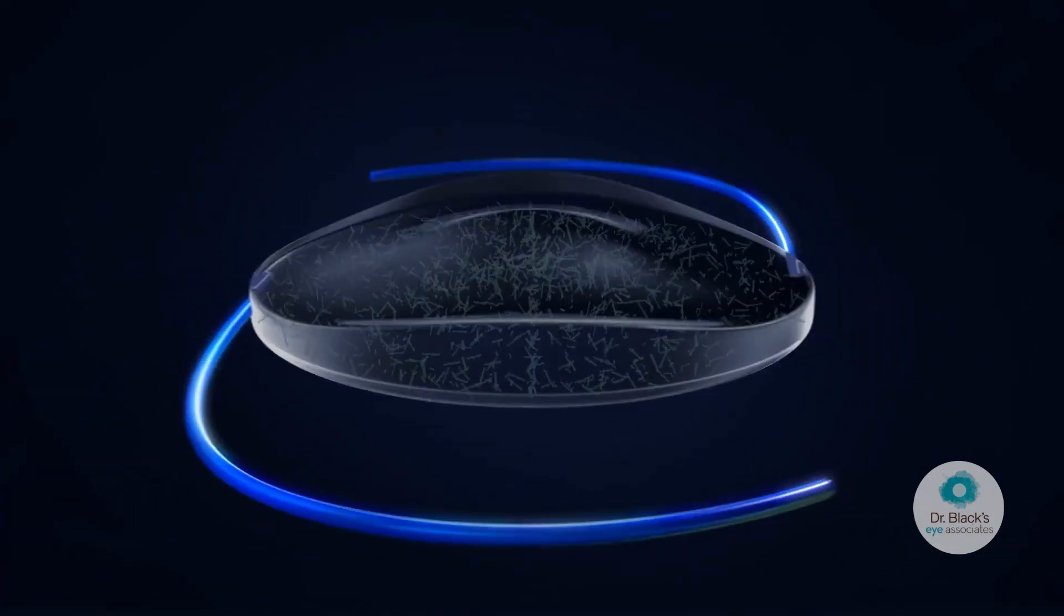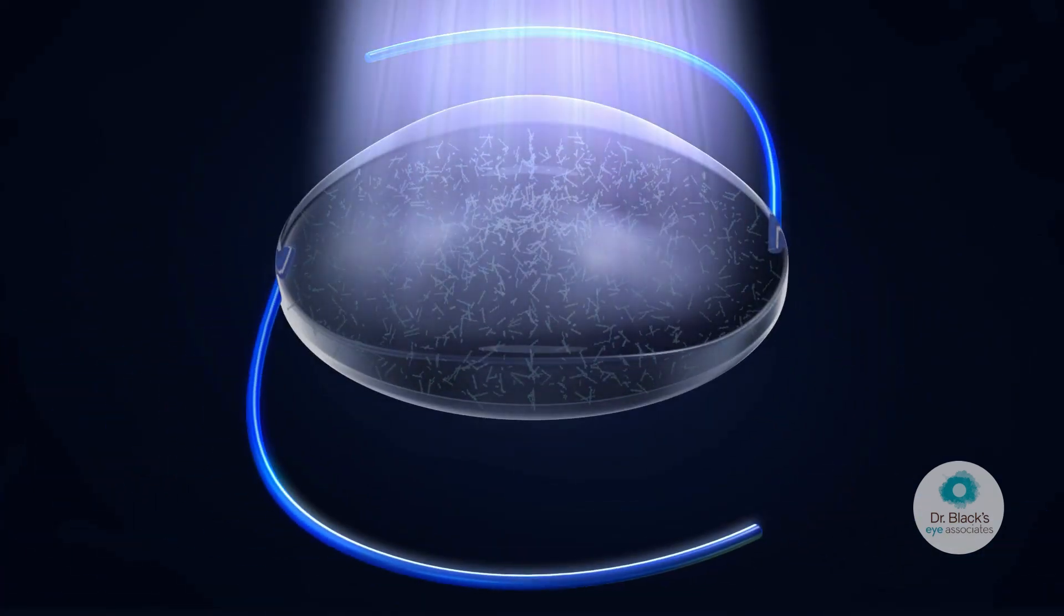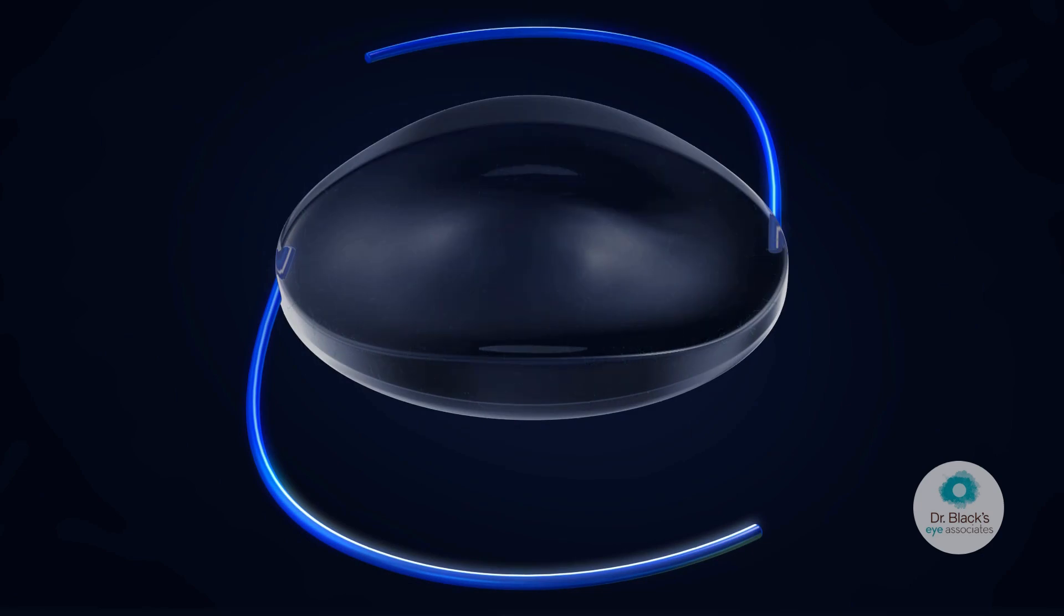the entire lens is exposed to the treatment light to polymerize all remaining macromers, effectively locking them in place to prevent any further changes.